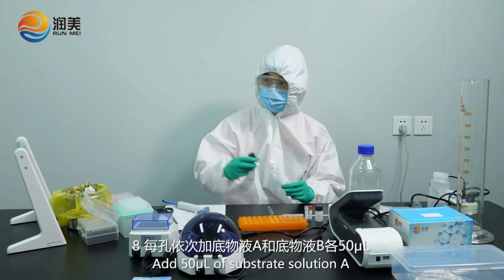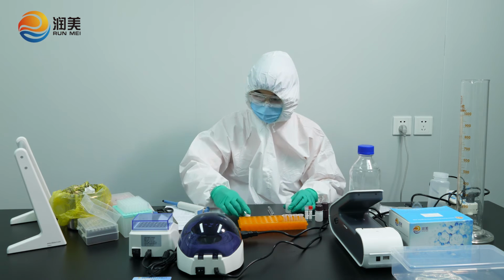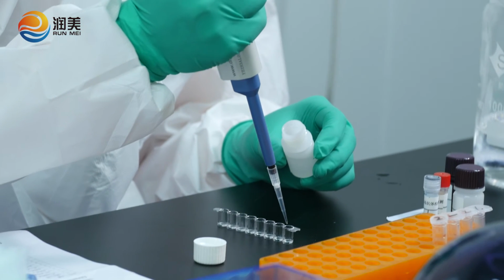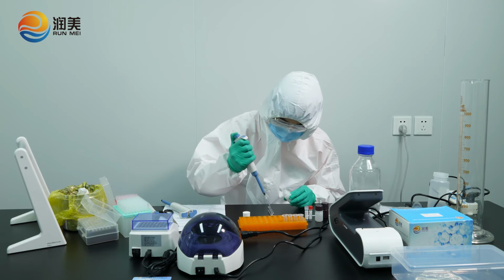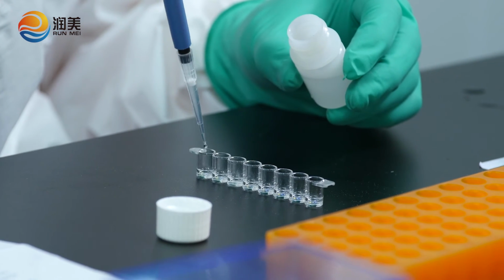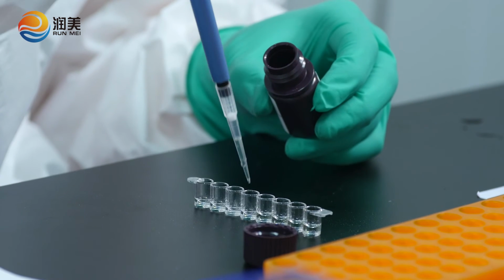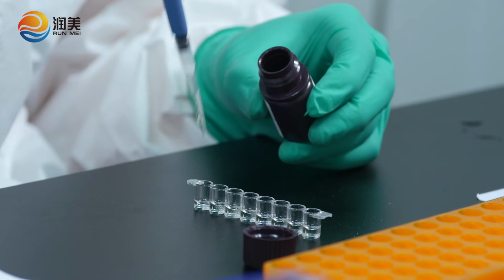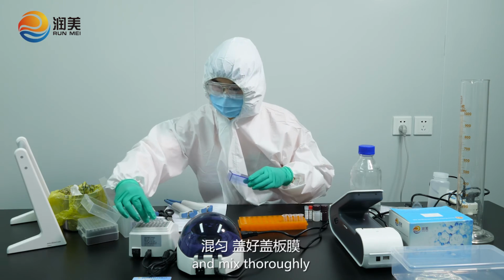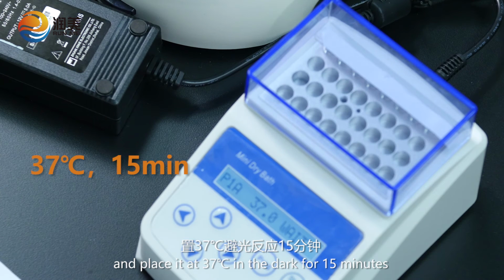Add 50 microliters of substrate solution A and substrate solution B to each well. And mix thoroughly. Cover the cover plate and place it at 37 centigrade in the dark for 15 minutes.